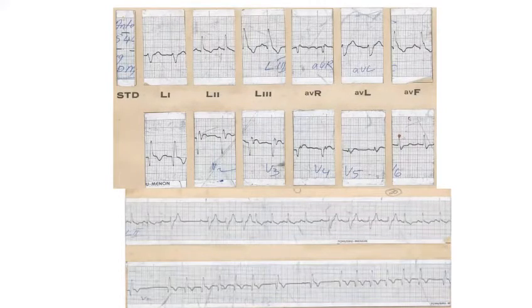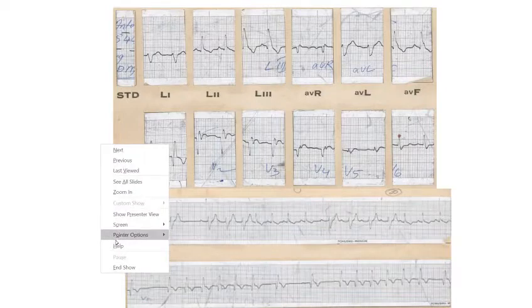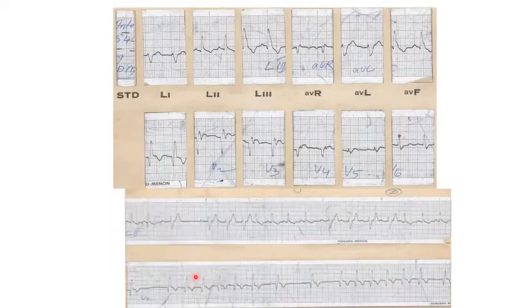The first two beats, sir. First two beats? No, in V1. I'm asking V1. The lower one is V1, and the upper one is lead two. So in V1, is there a change? No, sir. In V1, there is no change. No change at all. Why is there a significant change seen in lead two? Limb lead two. Yes. What is the condition in which in a limb lead there can be alteration in the QRS morphology, but there is no change in the pattern in the chest lead?